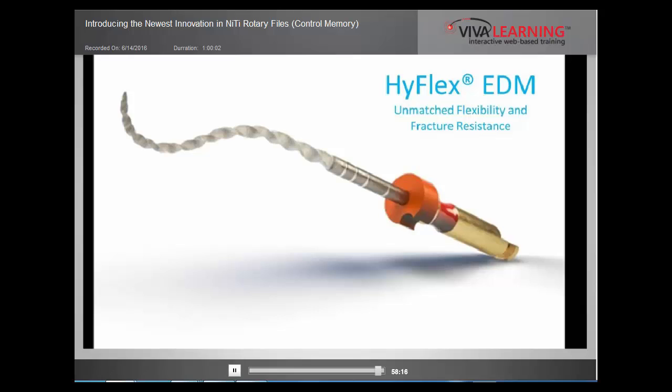The next question is, how do you access with a large MOD amalgam already present? In those large MOD amalgams, these days I remove the entire restoration because I want to make sure the tooth is not cracked underneath it. I am not weakening it because I'm simply removing a restoration that was there, and later probably it will get a full cuspal coverage. For joint canals in the lower molar, MBML, I'm not understanding the question. Next question.